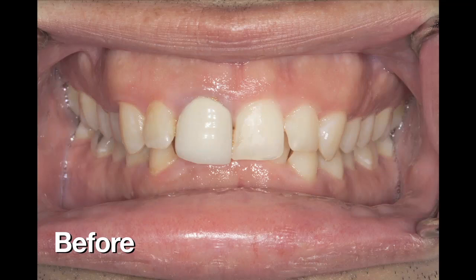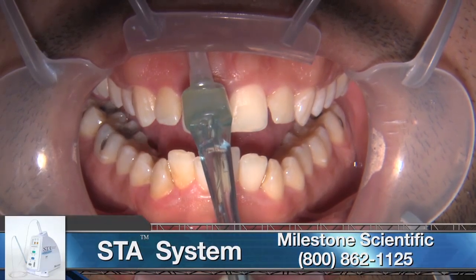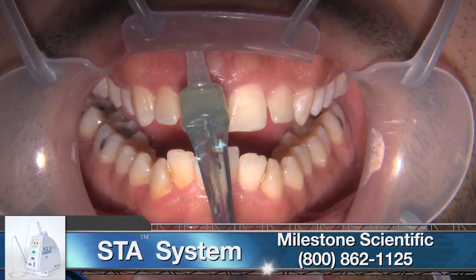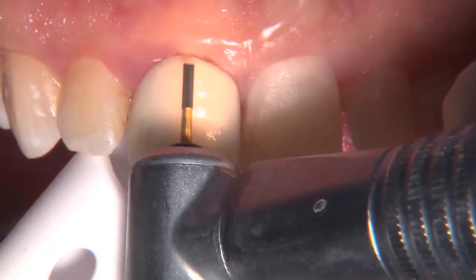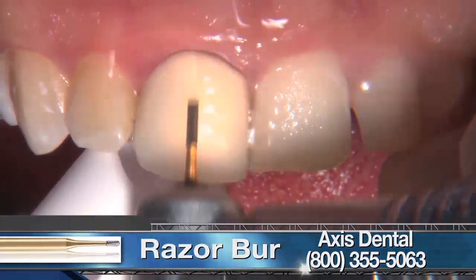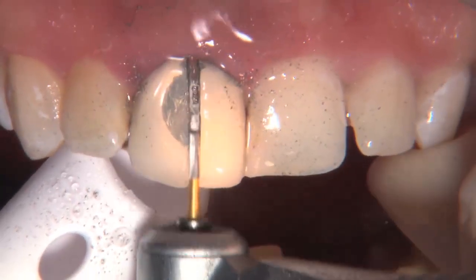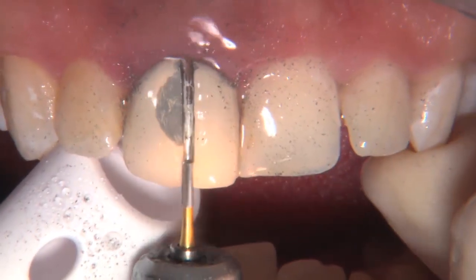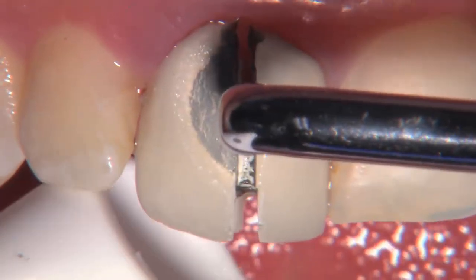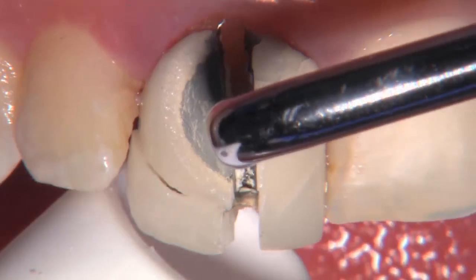As you can see, this patient's got a pre-existing PFM on tooth number eight — kind of high value, kind of opaque. He's a class two, division two. You can see that deep overbite. I like the idea of a Bruxer crown because I can keep it almost as thin as that PFM was on the lingual. That's a razor burr from Axis Dillon. What a joy it is to cut off a PFM these days after cutting off nothing but Emax and Bruxer. I feel like I'm on vacation — I literally will put my feet up taking off a PFM because it's that relaxing.